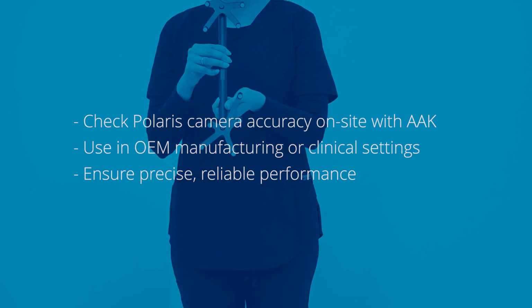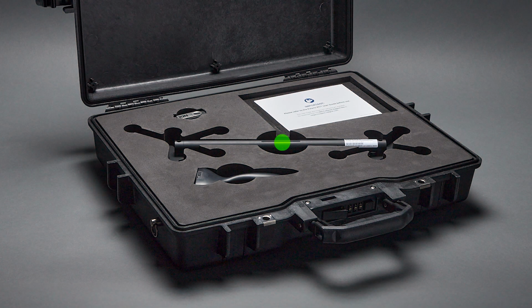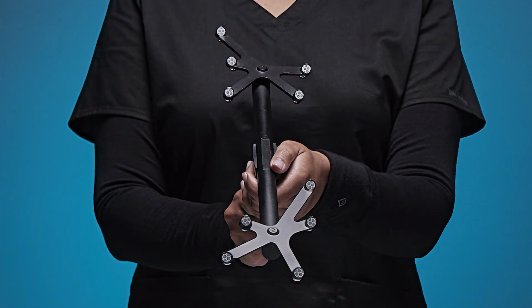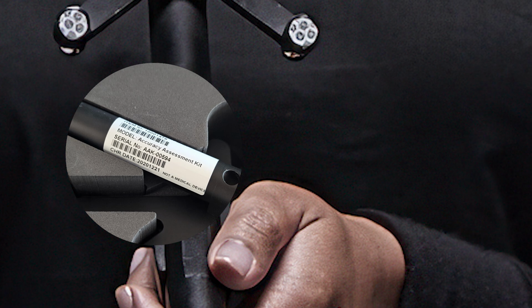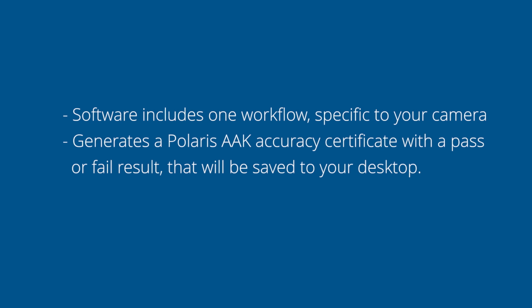and ensuring lasting precision. Your Polaris AAK includes a calibrated AAK tool, a tool handle, USB stick containing a tool definition file, and a product card with download instructions. The tool consists of two rigid bodies comprised of 5 markers on each end, and a sticker label with the AAK tool information. The Polaris AAK software includes one workflow specific to your camera and generates a Polaris AAK Accuracy Certificate with a pass or fail result that will be saved to your desktop.